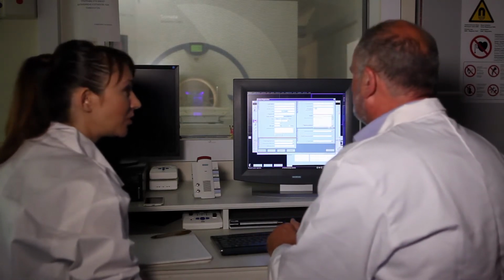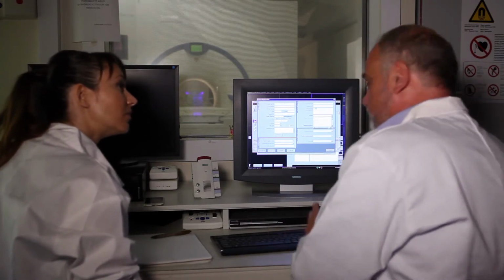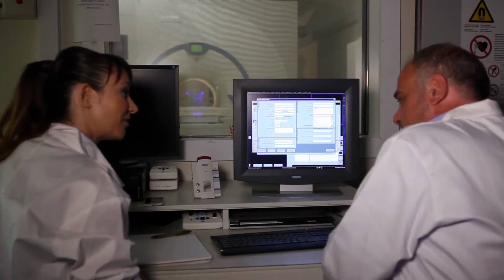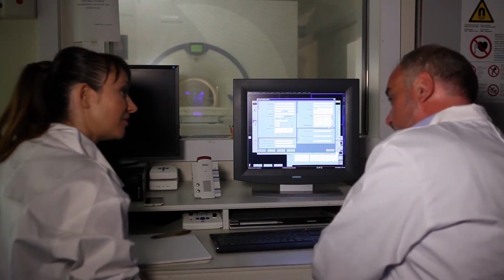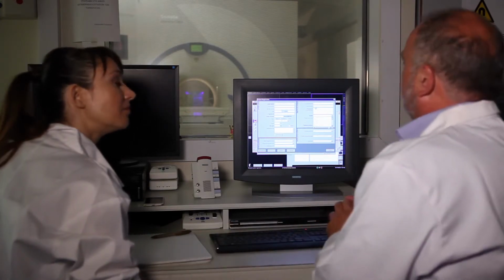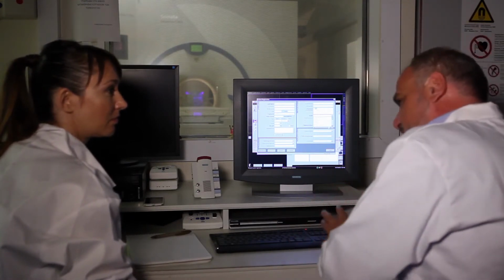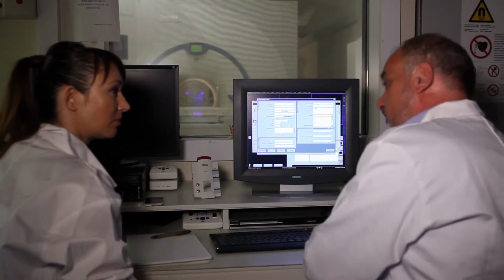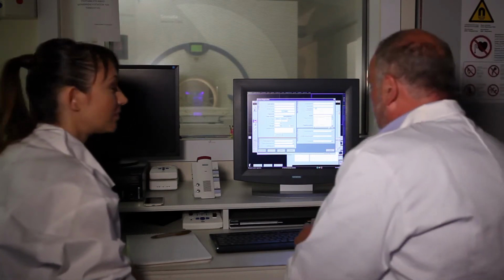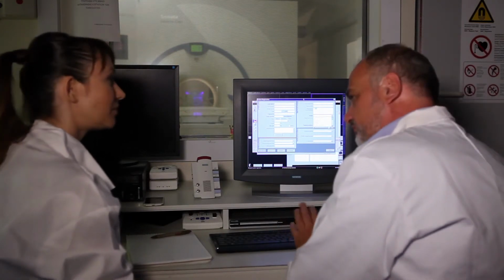Now, does the conductivity of the phantom match the conductivity of the human tissue? The constructors say that this should match. Actually, there's a lot of papers around on what solution to use. Okay, I got your point now. This specific phantom serves as a material which has the conductivity of tissues and the T1 and T2 of the tissues as well. So that is the point. It mimics tissue properties. It was appropriately designed and it's been used for let's say 30 years now, so it is a standard in general as a phantom.